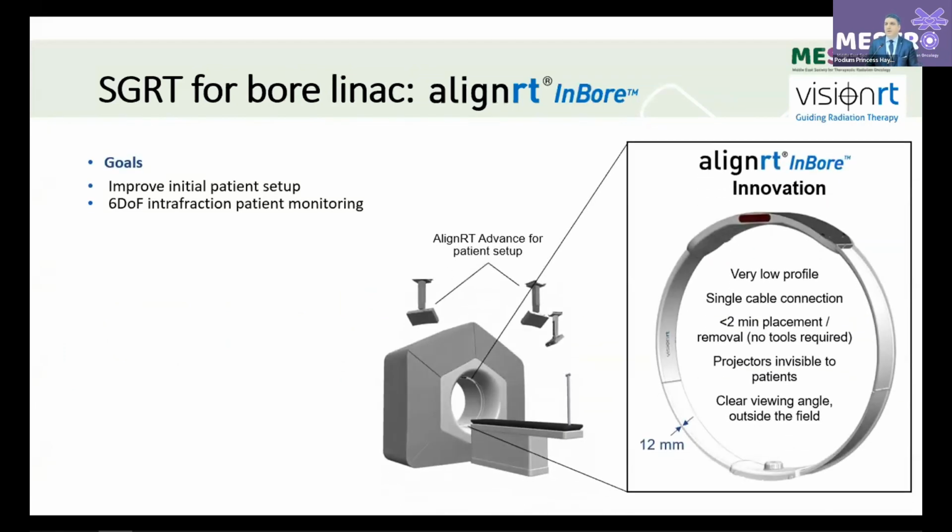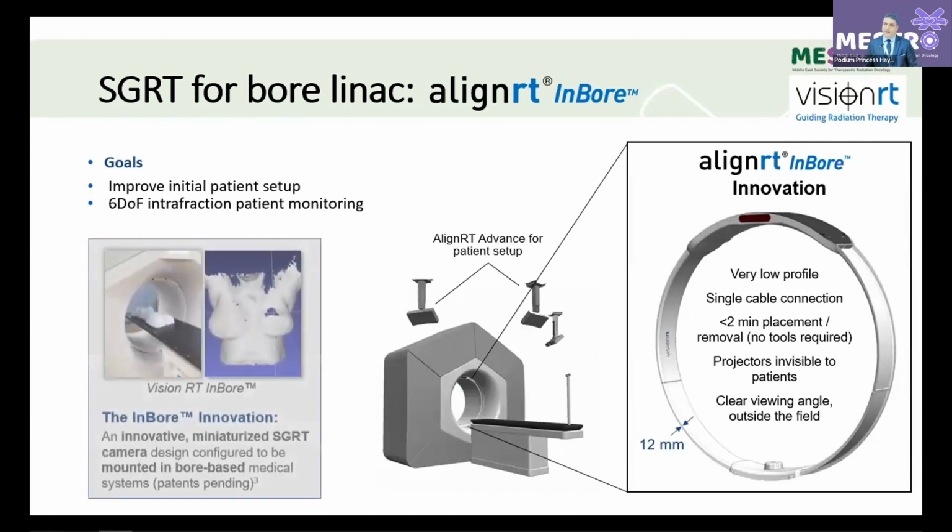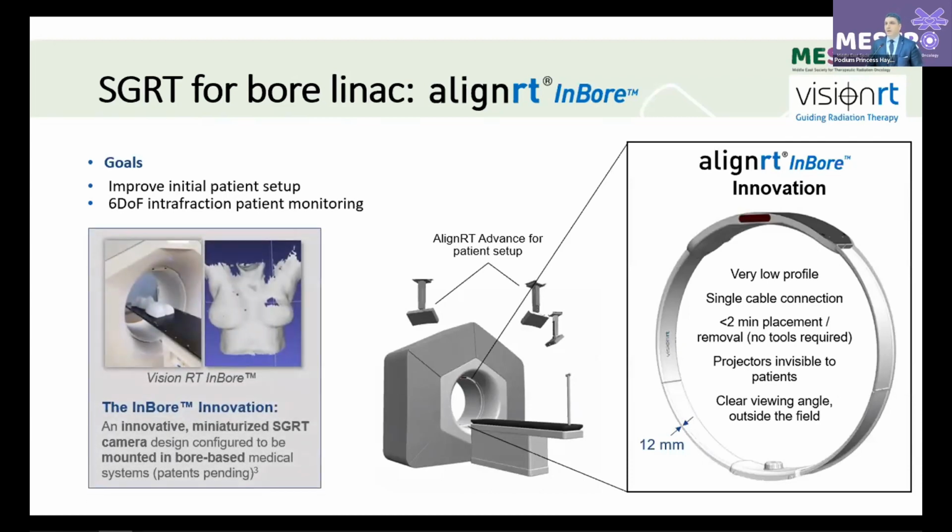With these new advances in SGRT, there come, of course, new form factors of the linac, like ring-based linac solutions with compact gantries. In this case, when we go into SGRT solutions, we know that as soon as the patient goes from setup position to the treatment position, we will not be able to visualize the patient anymore. There will be significant shadowing.